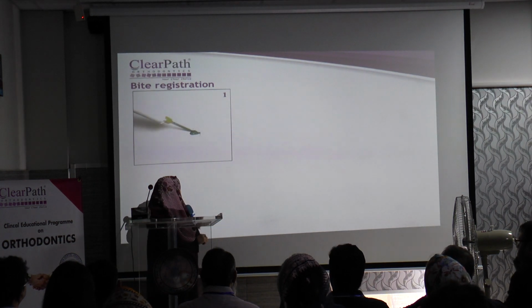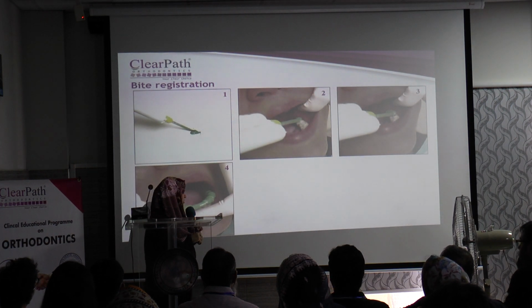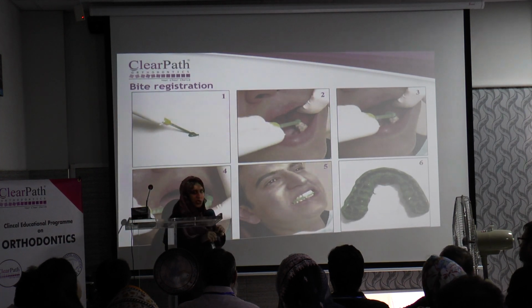Now this is a bite registration. The same putty you loaded onto the occlusal surfaces of the teeth. You ask the patient to bite, you wait for the setting, and the bite registration is ready.